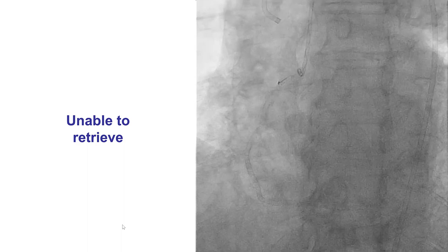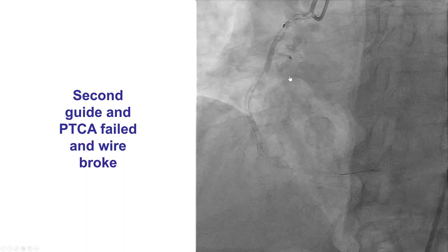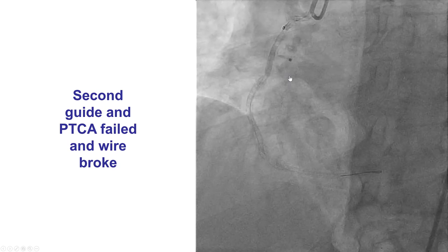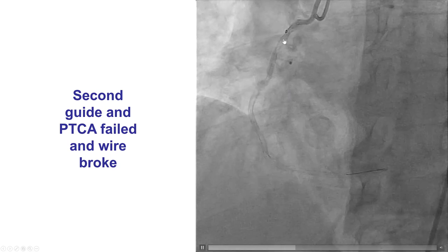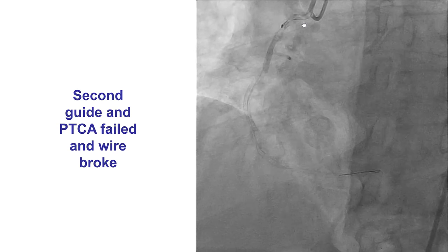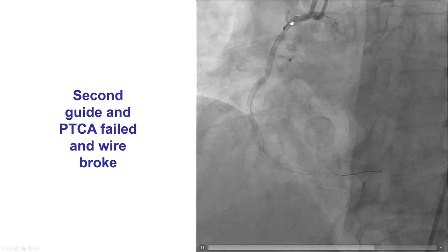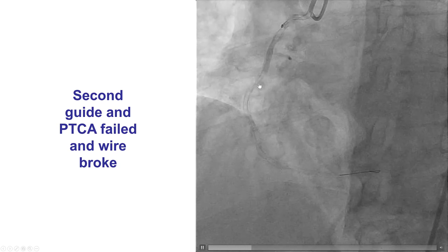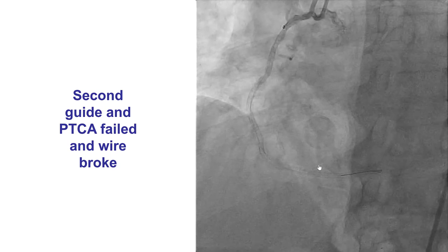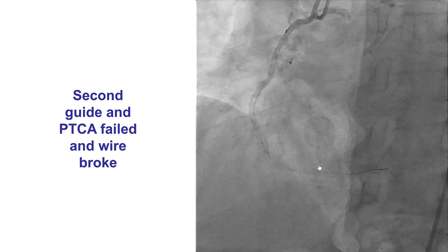In this case, we were probably fairly vigorous in pulling back. You can see the wire is already deformed. A second guide was advanced next to the wire and another wire was inserted in the right coronary artery in attempts to free it without success. And we can also see here Murphy's Law — complications beget complications. We had an issue with wire entrapment, and now we also have an issue with air embolism, with a lot of bubbles going down and no flow into the distal right coronary artery, leading to potential bad hemodynamic consequences as well as chest discomfort.